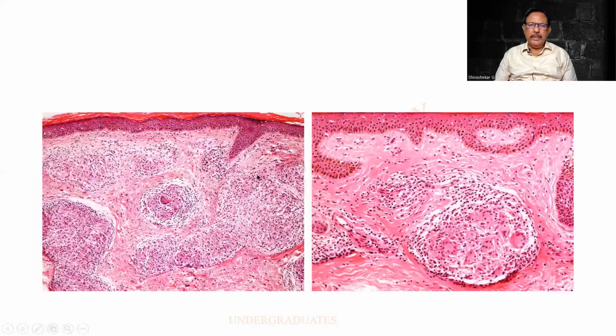Look at this particular case on the contrary. There is an epidermis. This is the rete peg or the rete ridge. So again, rete ridges are seen in this. In this case, multiple circumscribed lesions are seen. Sometimes they are joining, but I am able to see a giant cell also. At a higher magnification, this may be focused. I am able to see a Langerhans giant cell, no necrosis.